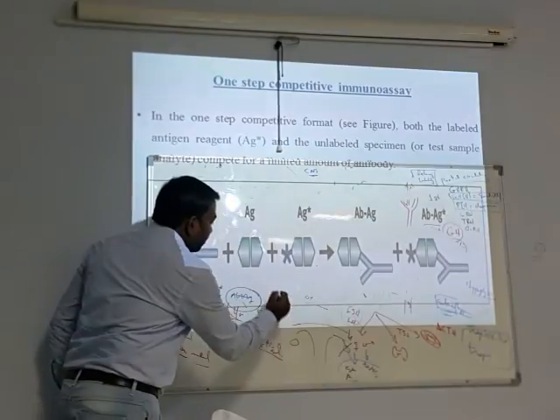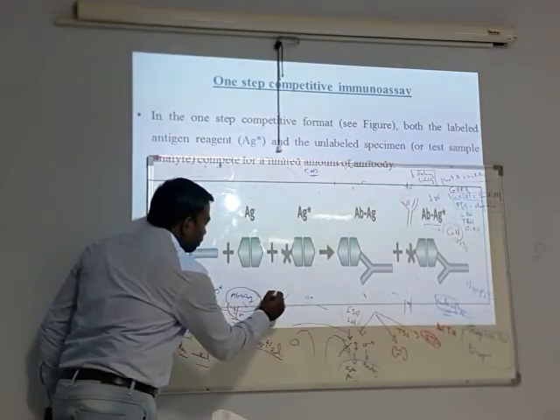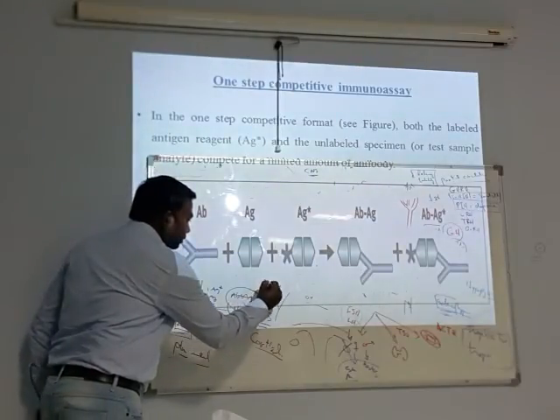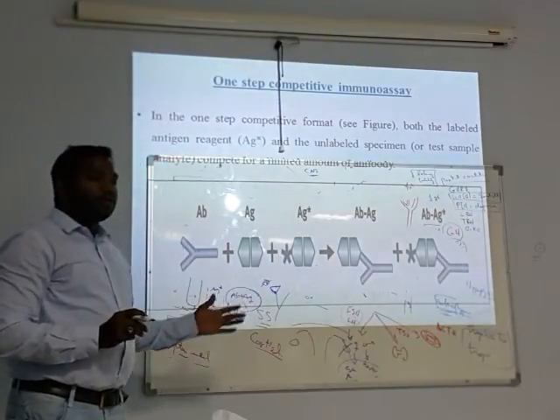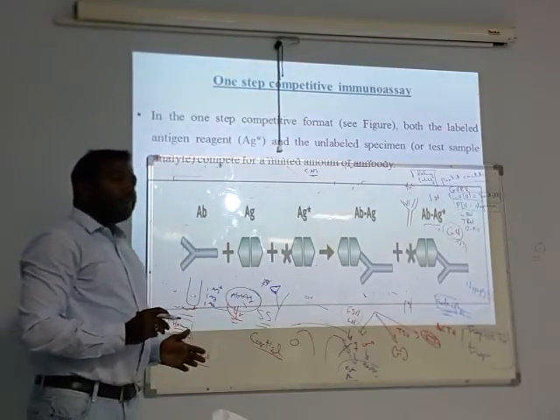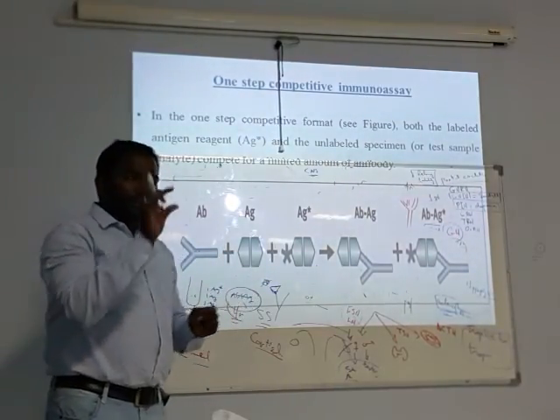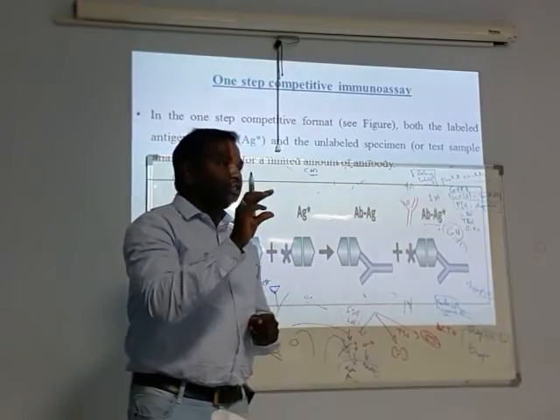Our antibody binds with the antigen, which means this is positive, because the sample contains specific antigen.